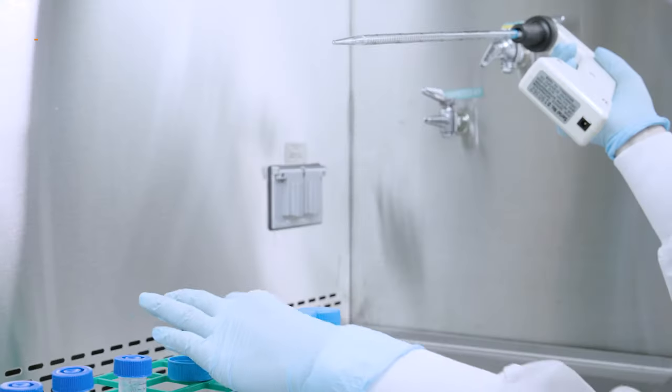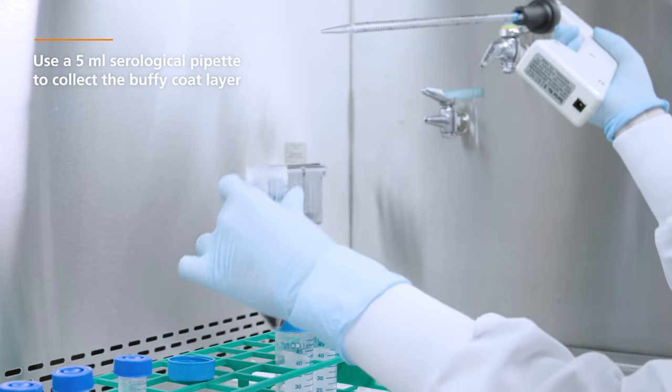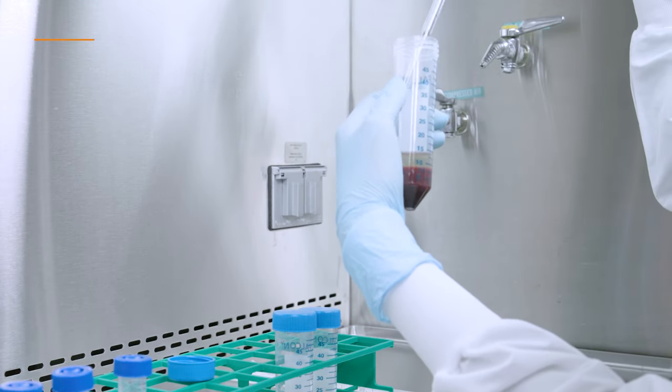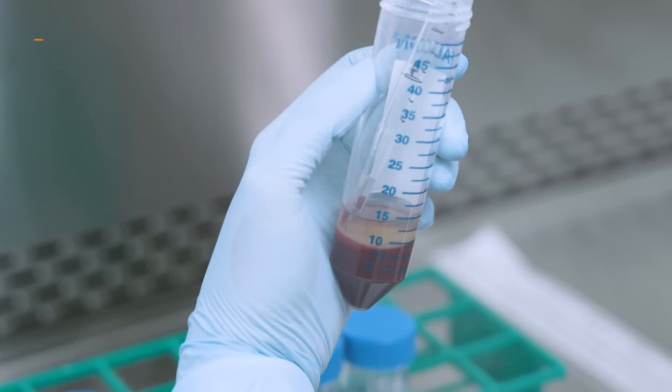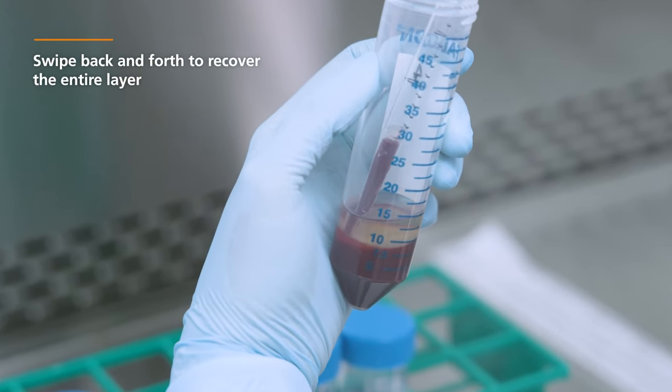Then, use a 5 mL serological pipette to collect the Buffy Coat layer. Start collecting from the tube's edges. Swipe back and forth to recover the entire layer.